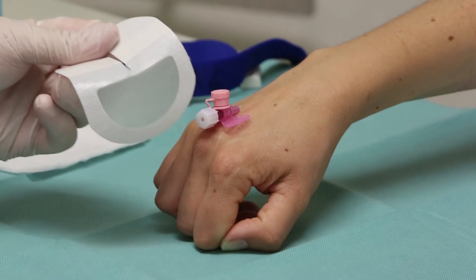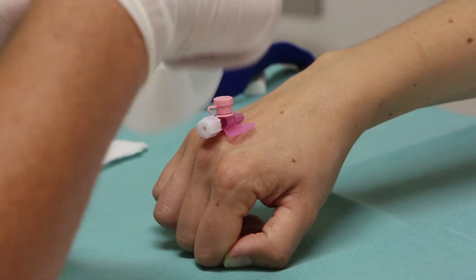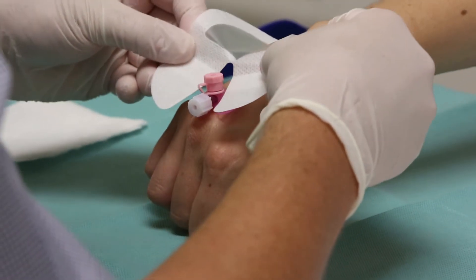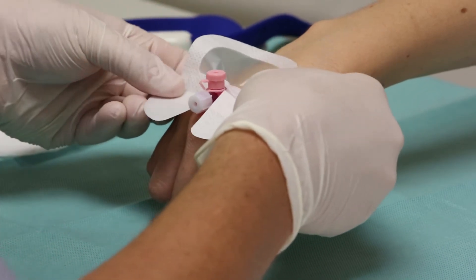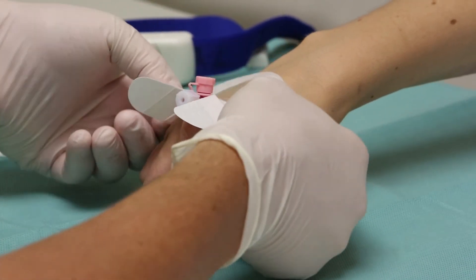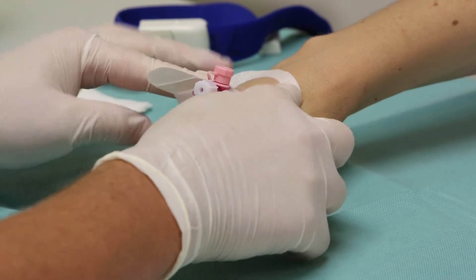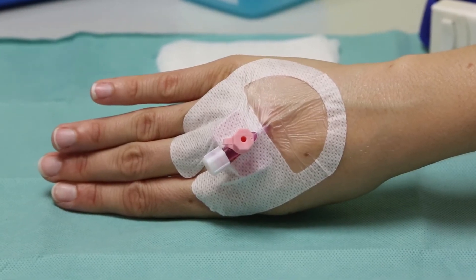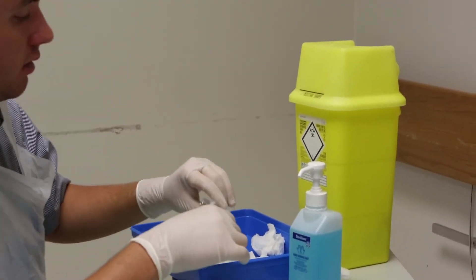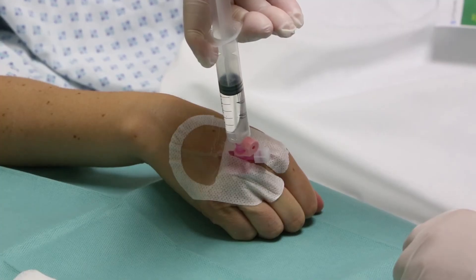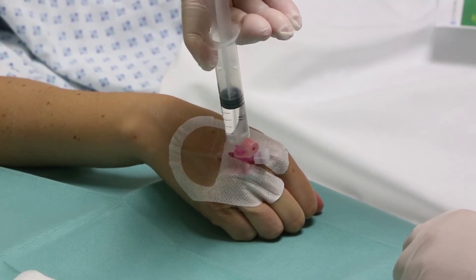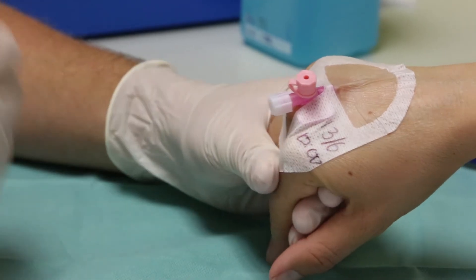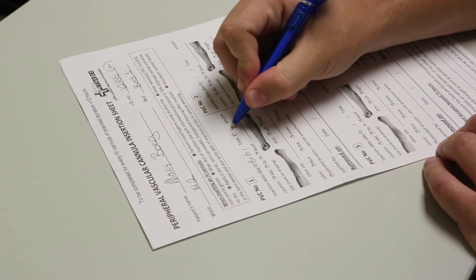Step 13. Apply a transparent semi-permeable dressing. Ensure the cannula exit site is clearly visible and the cannula is properly fixed. If the primed extension set is being used, remove the stopper and clean the port with 2% chlorhexidine in 70% isopropyl alcohol before connecting. Flush the cannula immediately and document the date and time of insertion on the cannula insertion document.